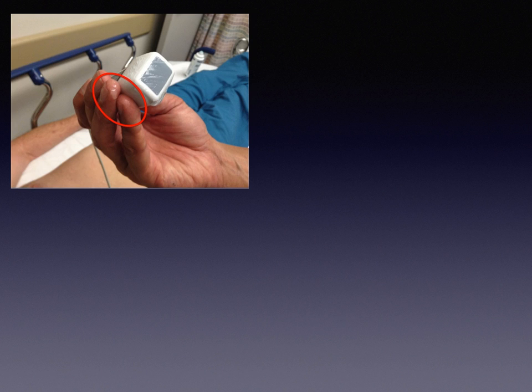And work efficiently so that it takes less than a minute. Our residents can perform it in less than that time. This is what years of applications have taught us. The grip we've evolved is shown. The last two digits are the only fingers that touch the patient and are usually used to stabilize the probe. That's why they have gel on them.